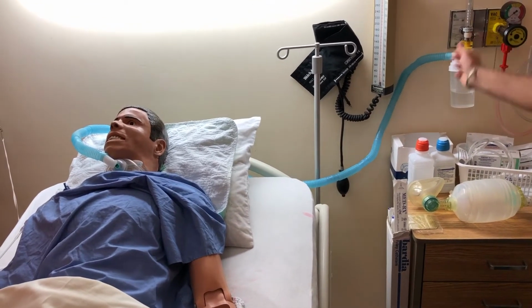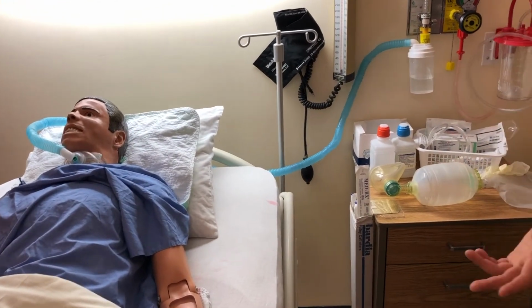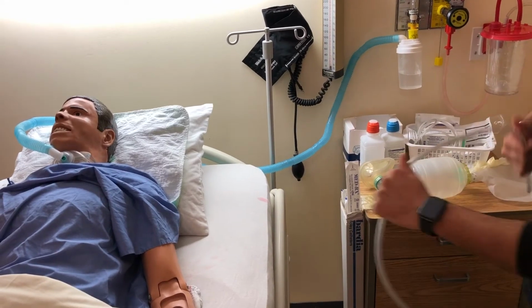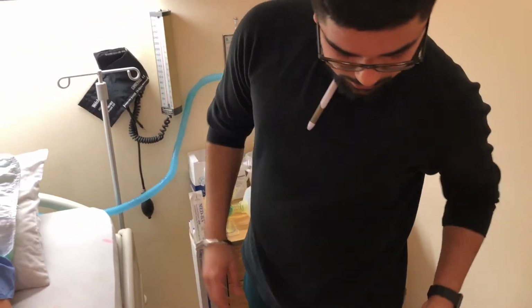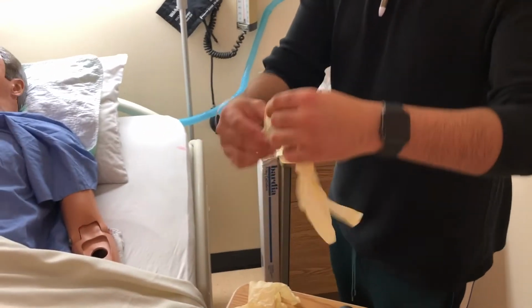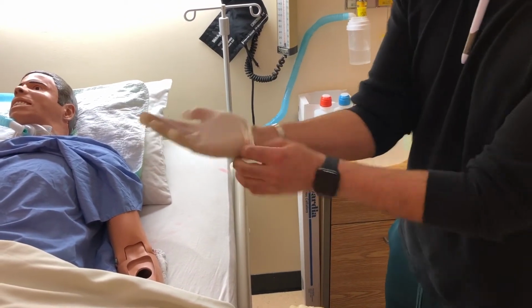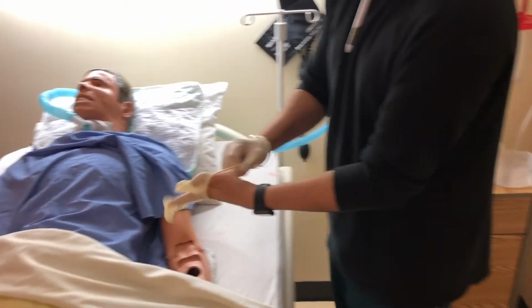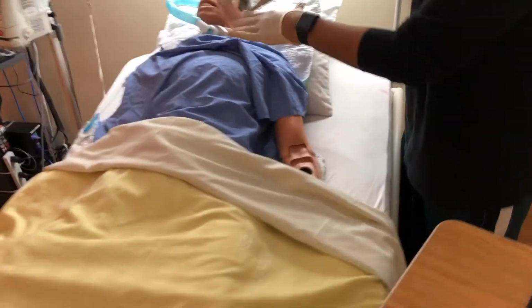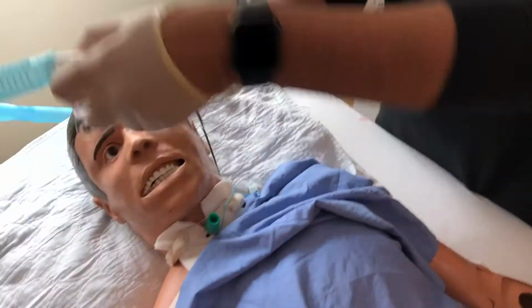And now what we want to do is do our suctioning. So we have our suctioning equipment here. It should be working. However, in this case, it doesn't seem to be working. So we have this. And then we want to put gloves on for this part. We could put double gloves just because that's how the procedure works. So the way that we want to do this suctioning is take off this part right here. Just as such. Take this guy off there.